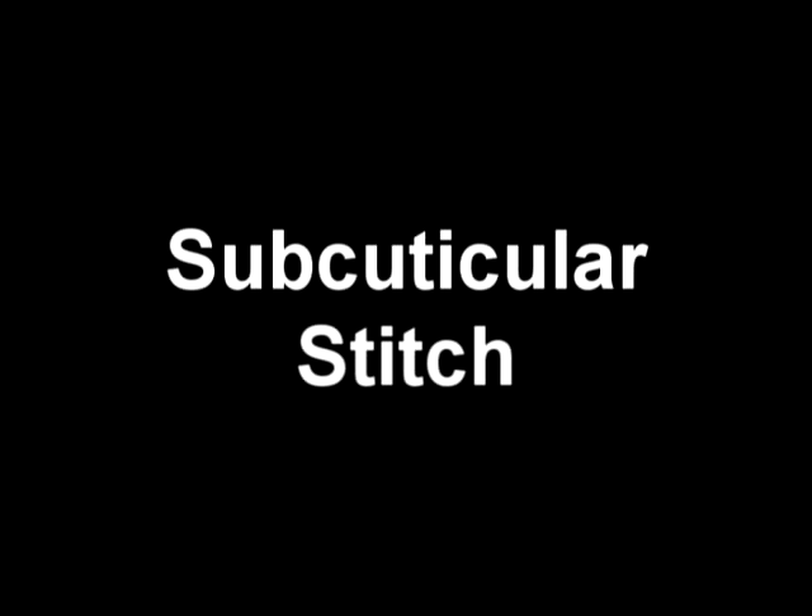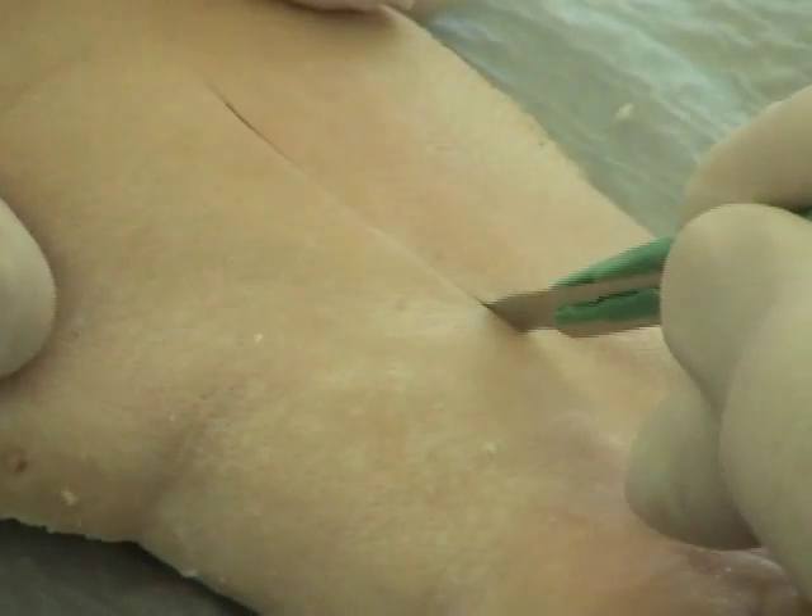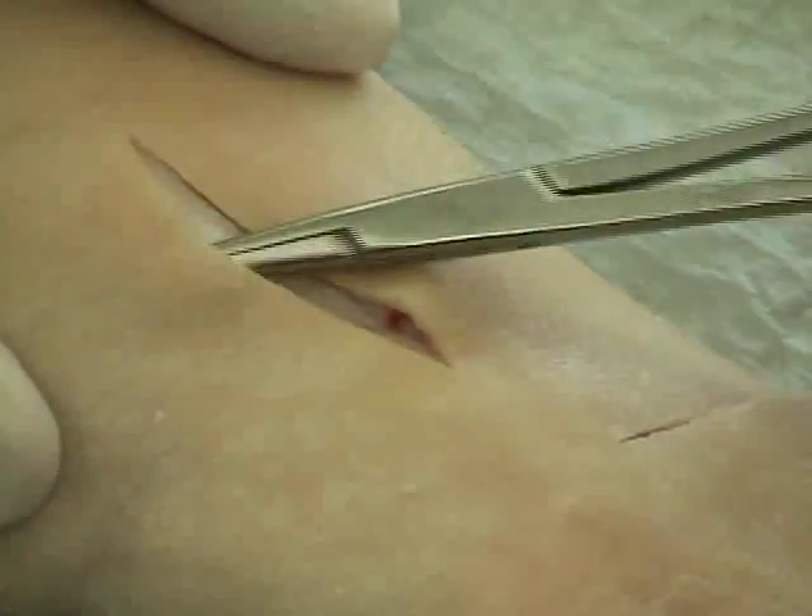We're going to be doing a subcuticular stitch. The subcuticular stitch is a stitch that's designed to have minimal exposure on the skin surface. I'm cutting it through the skin. This can be done with an elliptical excision or with just a straight incision like I'm doing here — it can be done either way.